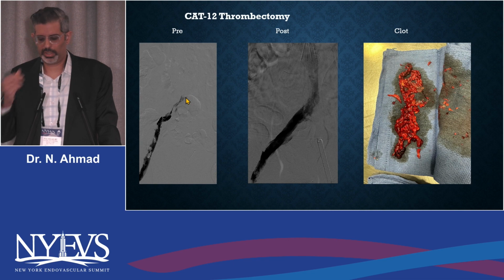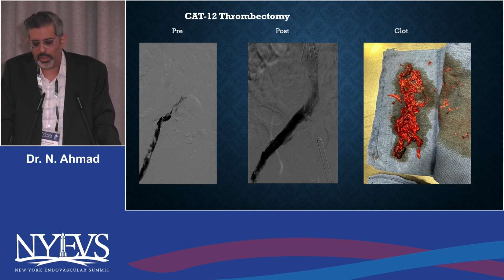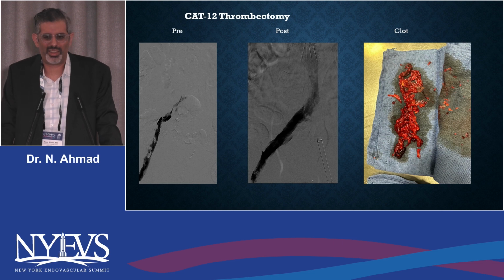So the way I approached this case, again, this is my first case with Flash. I didn't know I had Flash on the shelf at this point. My usual algorithm for acute clot, if I know it's acute with a wire test or based on the history, is that I use Cat 12, because Cat 12 is really good for aspirating acute clot. I don't like to say chronic with Kush Desai on the panel here, but when it's subacute clot or old clot, that's when I switch over to ClotTriever, FlowTriever, and other devices, because honestly, Cat 12 wasn't a great catheter in those situations.